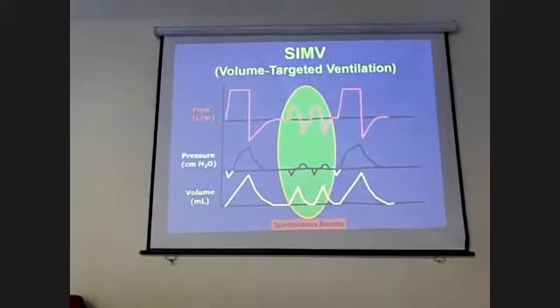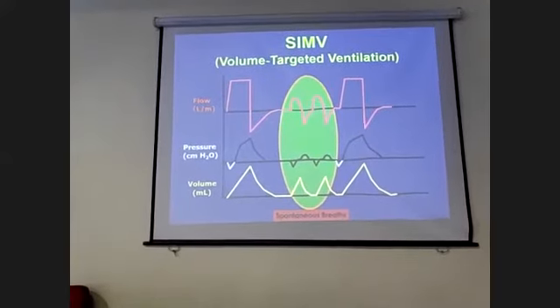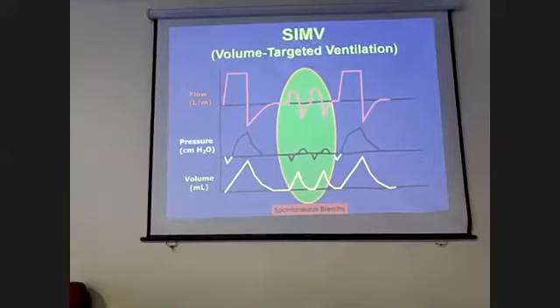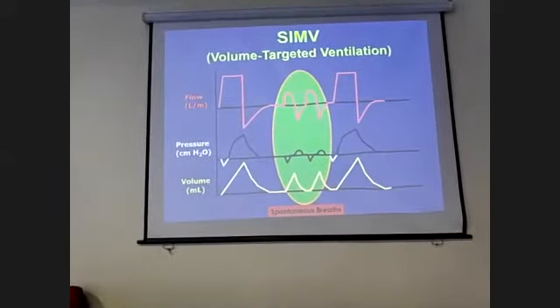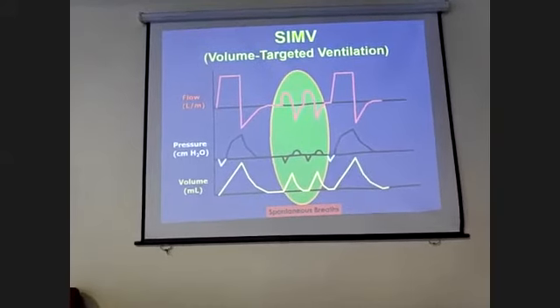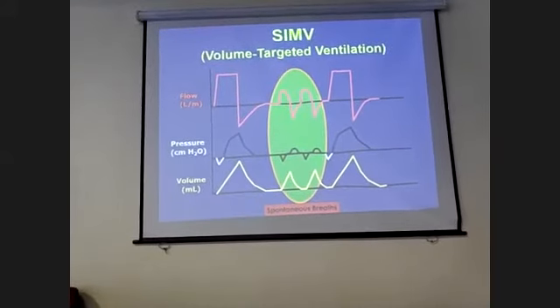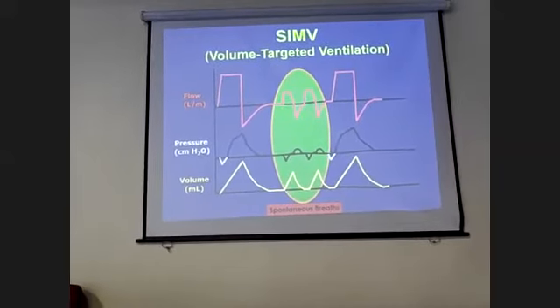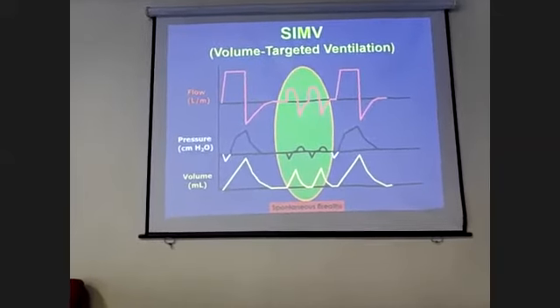Now, as I said, with SIMV, it doesn't mean that the ventilator is synchronized with the patient. And SIMV mode always needs two assistants. One is pressure support and another is CPAP. Otherwise, it is a dangerous mode. Why is it dangerous? Look at this.